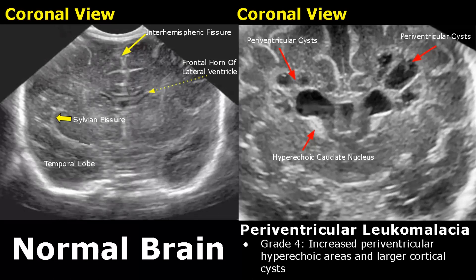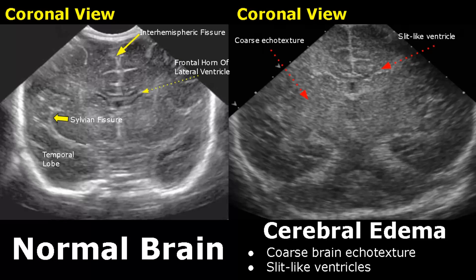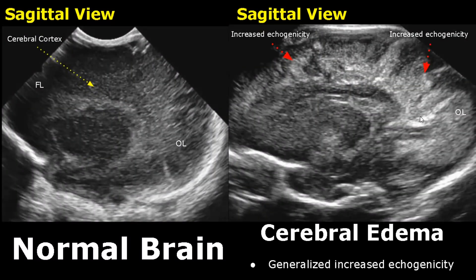Appearances of cerebral edema include coarse brain echo texture — rough areas that are slightly hyperechoic are seen, and the ventricles are difficult to visualize with a slit-like appearance. This sagittal view of cerebral edema shows overall increased echogenicity of the brain with many bright areas.